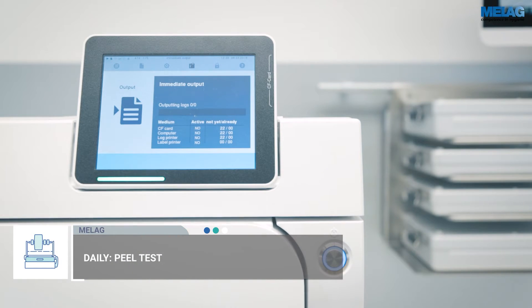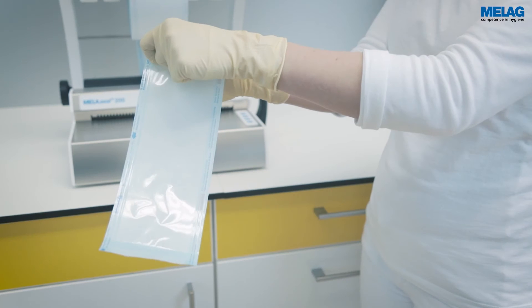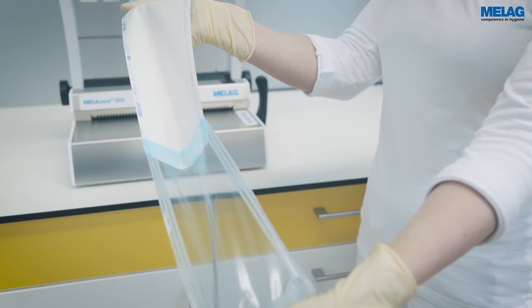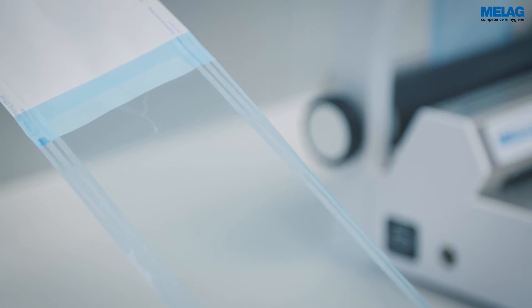To conduct this test, sterilise the sealed packaging. Take it from the steam steriliser and pull the seal seam apart slowly in the peel direction. The force to open a properly sealed pouch has to be equal for all four seal seams. The paper should free itself from the foil, leaving almost no residue.